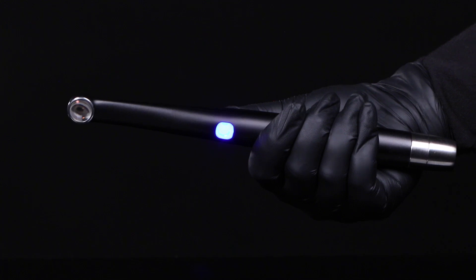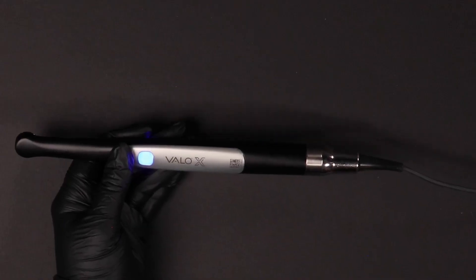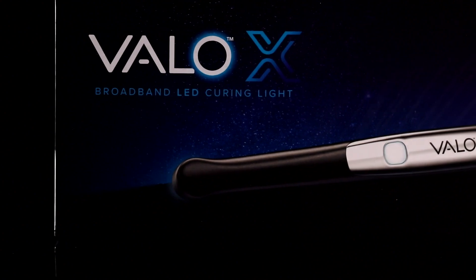Your VALO X Curing Light can be powered in two different ways. Whether you prefer uninhibited, battery-powered, cordless operation, or the reliability of corded operation, your kit comes with everything you need.